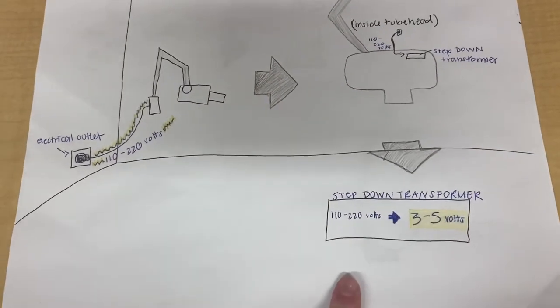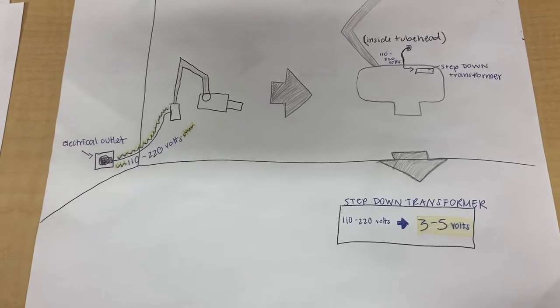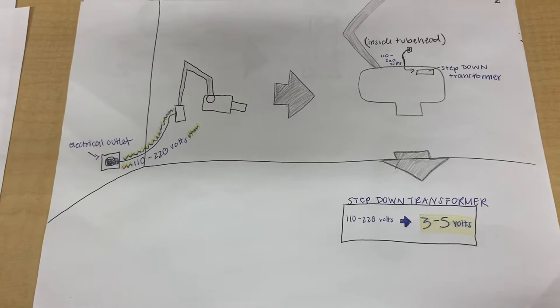And as you can see here, the step-down transformer, also known as the low-voltage transformer, will convert the incoming voltage into 3 to 5 volts.